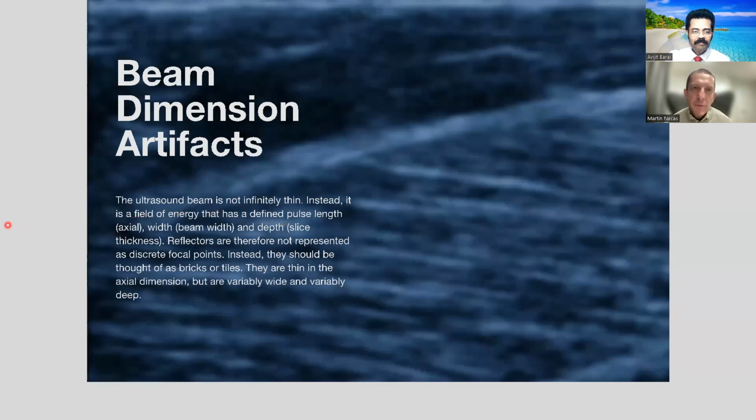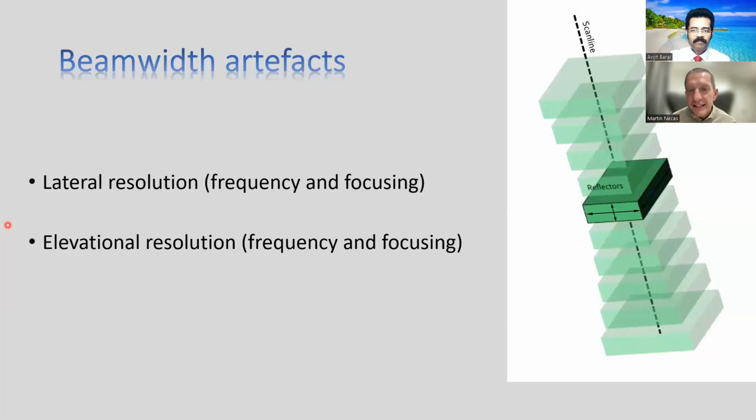I think what I like to relate it to is how ultrasound is different to, for example, CT scanning. On a CT image, a pixel of information is very uniform. It's like a sugar cube. So CT is an isovolumetric imaging technique in that the same object viewed from different angles will tend to produce very similar appearance and similar dimensions. Ultrasound is very much not like that.